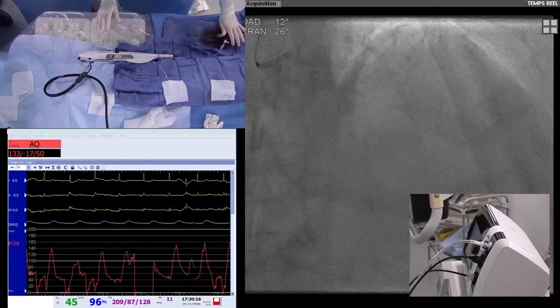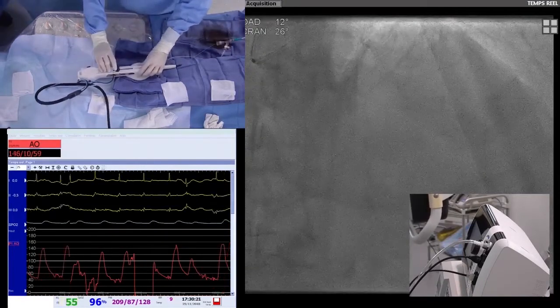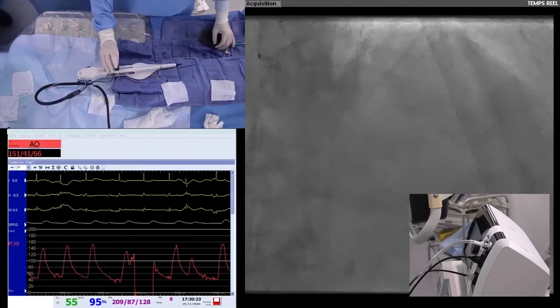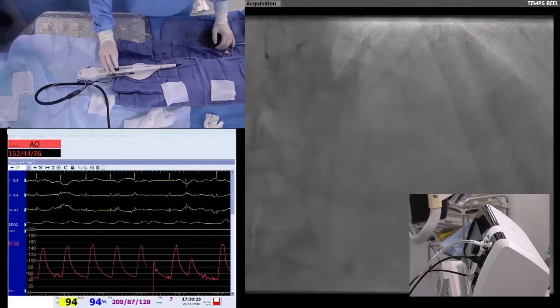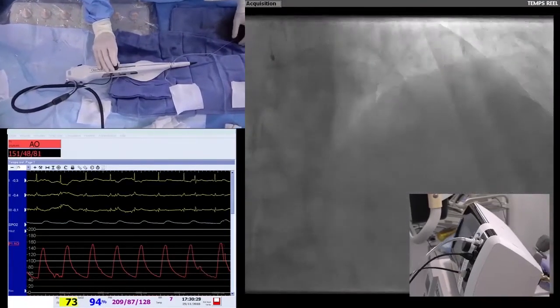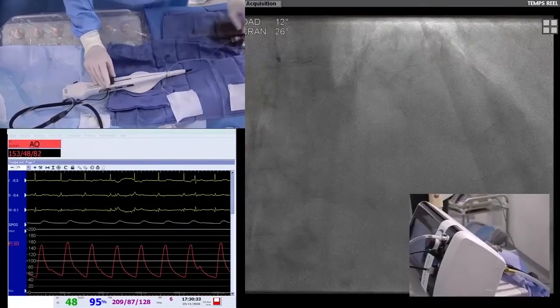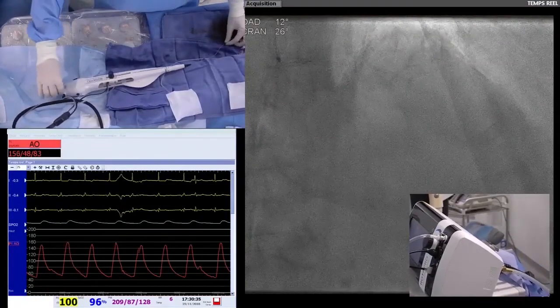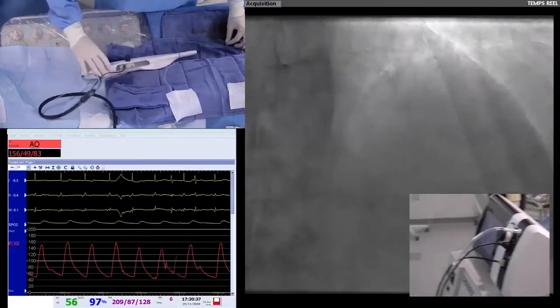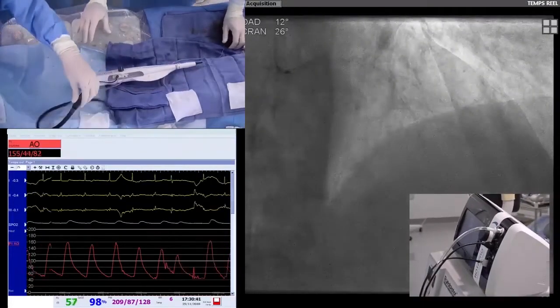Usually, I have to push in the button. There is no pedal. You will see the burr is sometimes advancing a little bit, and thanks to that, you release the friction. So it advances only 5 mm, but thanks to that, it will be easier to advance and to start. So I will just check in the ostial part.